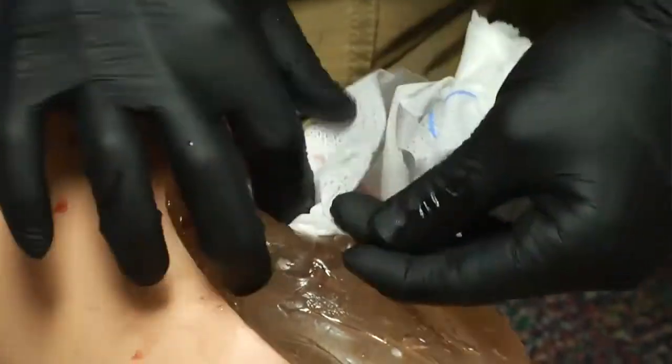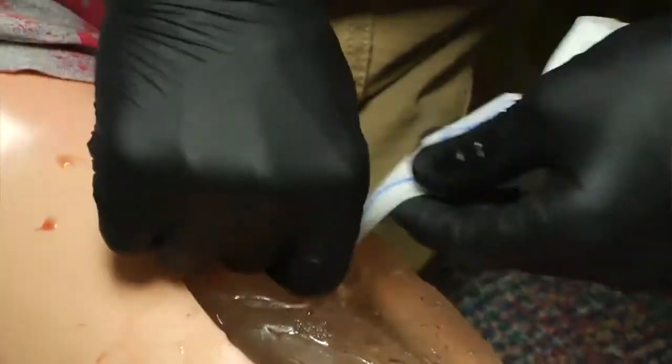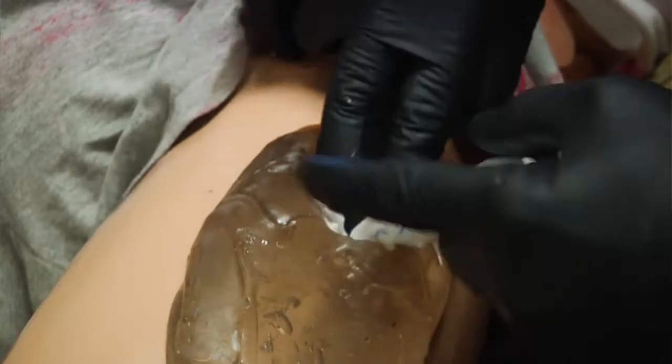This gauze fills that wound cavity. As you see Mark packing that into the cavity, it fills it up so that it backs up that pressure he had there with his finger, keeping that pressure on the vessel that was bleeding to try and keep this person from bleeding any further.